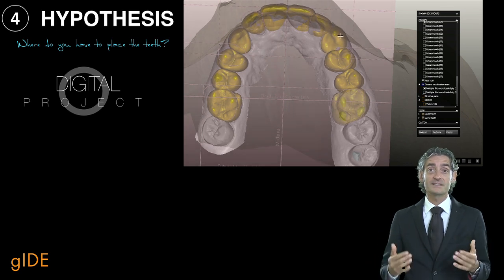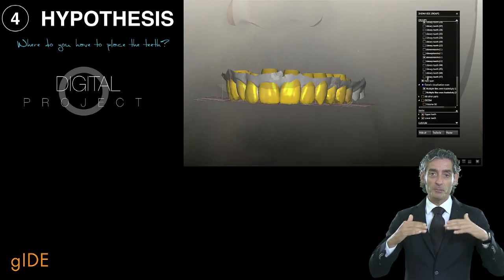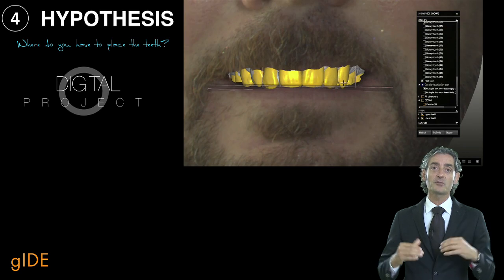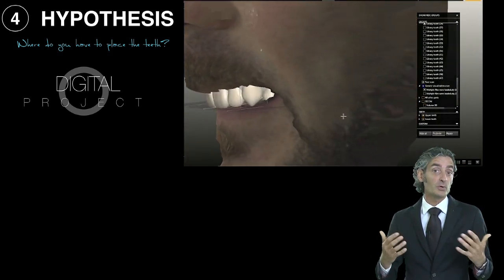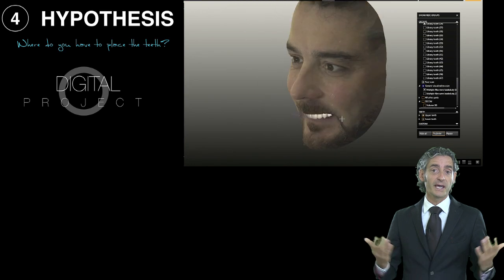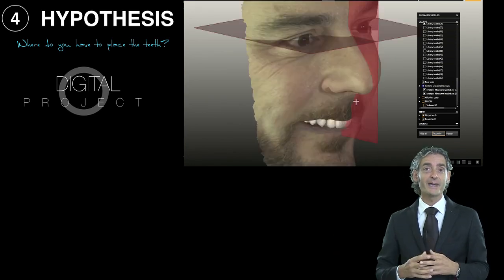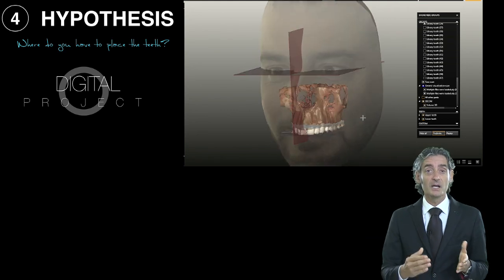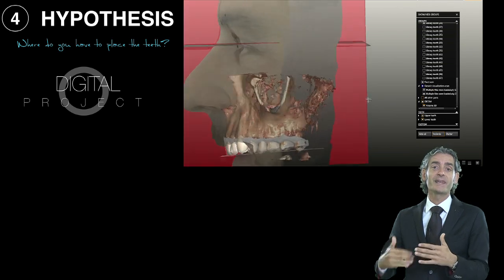And right now for us it's really easy to see, for example, with plan. Look at here, right now I'm planning to position my central incisor, the canine, and the lateral accordingly to my horizon. For us it's really important to evaluate a situation like this. And then we can share with the patient this idea of aesthetic, and then we will analyze much better in the mouth of the patient when we will have the pre-visualization, so the next step.